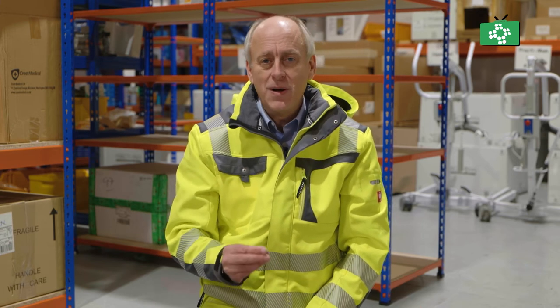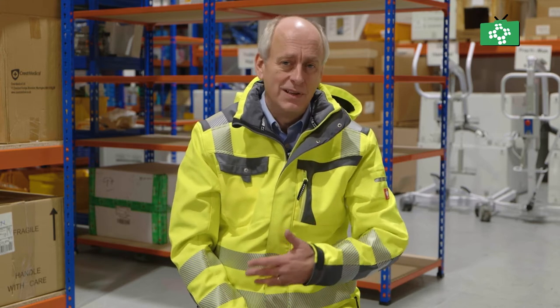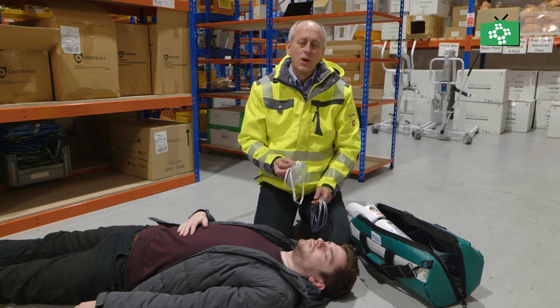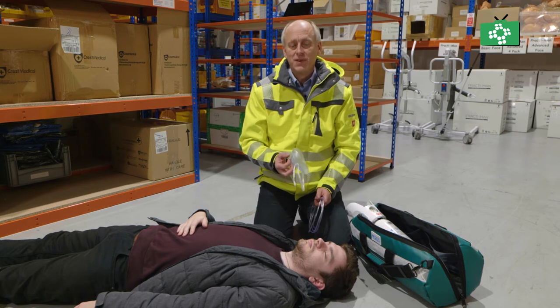The pocket mask provides a good barrier against infection. It's a very efficient way of getting air into the body because it's blowing into the mouth and the nose, and chances of recovery are as good as you can get within doing CPR breaths. The pocket mask is a single-use device — they're not very expensive, only a few pounds — and you literally throw it away after use and buy another one. Now we've learned how to put a pocket mask on, we're going to look at how to use supplementary oxygen.